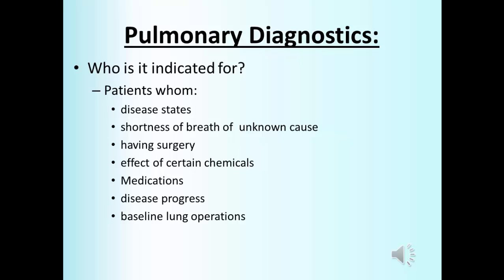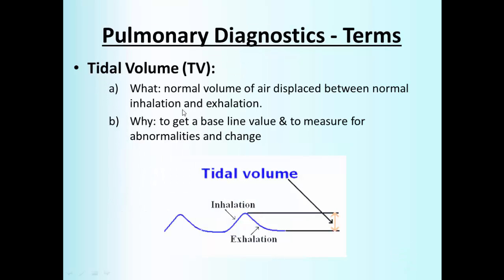A pulmonary function test takes about 15 minutes for an adult and about 15 to 30 minutes for children, and 45 minutes if you are doing pre and post bronchodilator testing, or a full hour if you're doing a full set of PFTs with the diffusing capacity of the lung for carbon monoxide testing. And usually about 5 years of age is the youngest that a kid can be to cooperate with the procedures of pulmonary function testing.